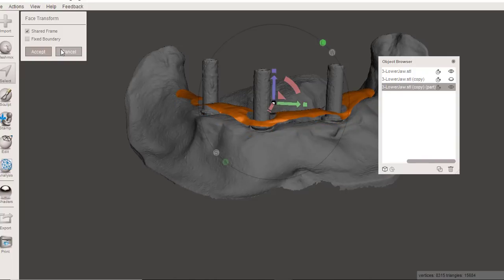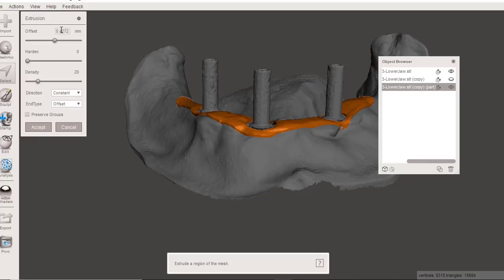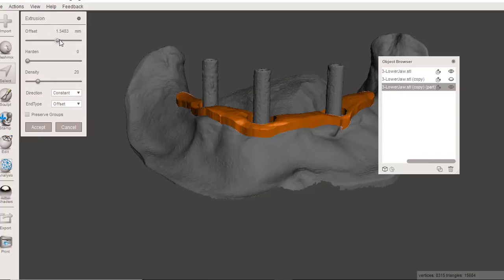Oops, wrong button, sorry. It should have been extrude. So go back with this selected, it's extrude. And that's in your edit menu. And let's go up a good bit with this.